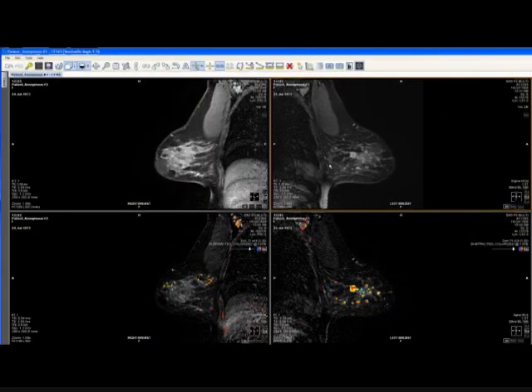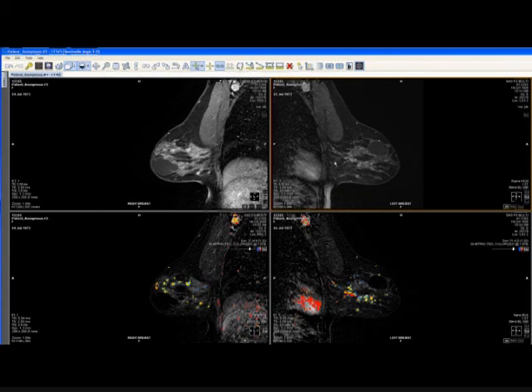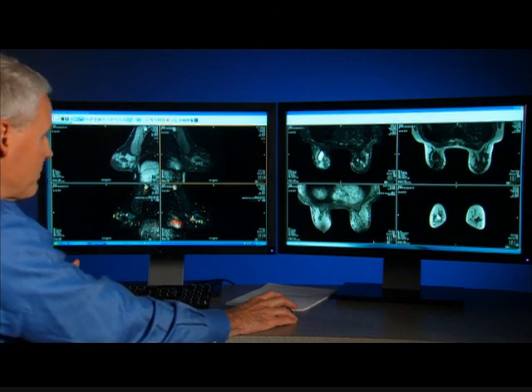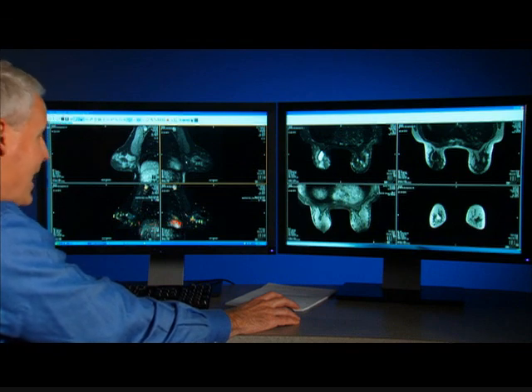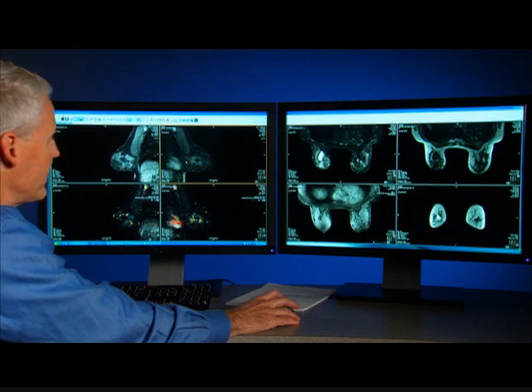And as we reviewed this, we didn't see any dominant lesion that stood out. But in this instance, I think you pretty much have to communicate that the degree of background enhancement significantly is going to limit the sensitivity of this patient's exam. Depending on the mammogram, we will sometimes recommend a 6-month follow-up mammogram, and really the purpose of that is to make sure that everything appears stable, and then you have to rely on a 1-year follow-up MRI to determine, has anything changed, at which point then you might be led to intervene and perform a biopsy.